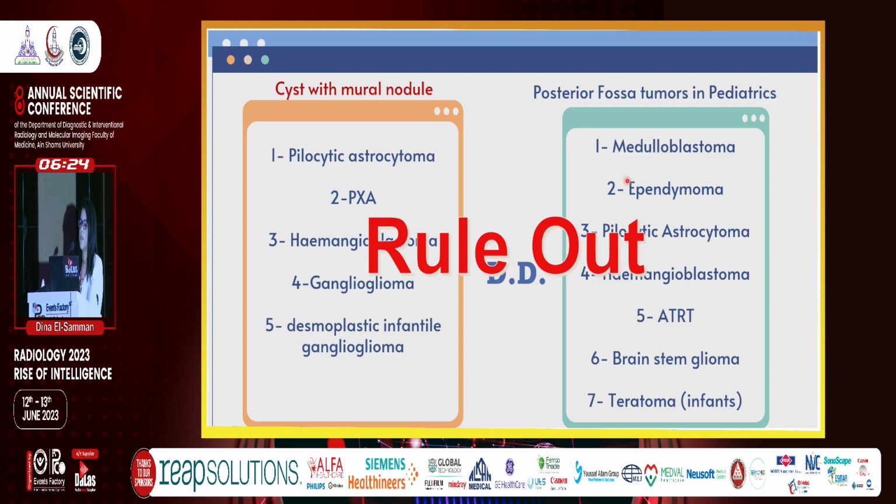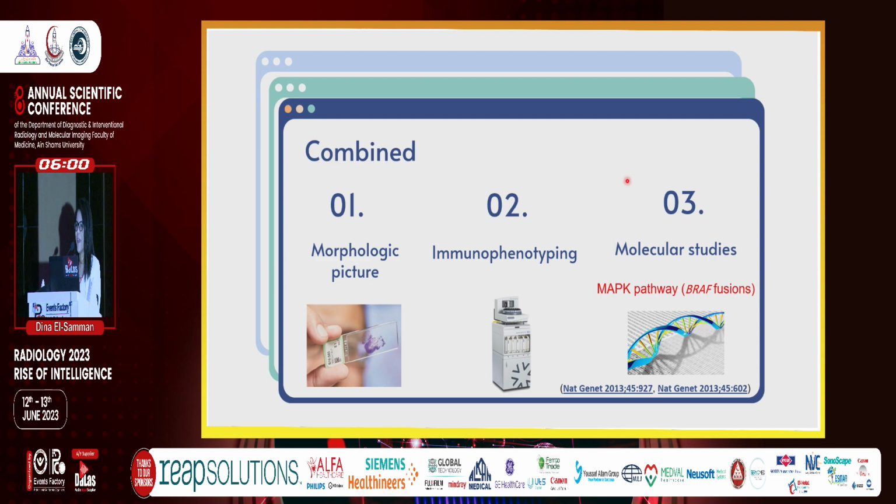Sometimes we find pilocytic astrocytomas with MVPs, with oligodendroglial-like cells. Sometimes they may have focal necrosis, multinucleated giant cells, areas of degenerative atypia, slightly elevated mitosis, and very, very rarely anaplasia. These are all atypical presentations that we need to consider, taking slow steps before we sign out our report.